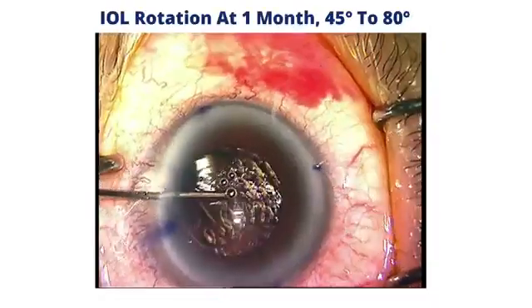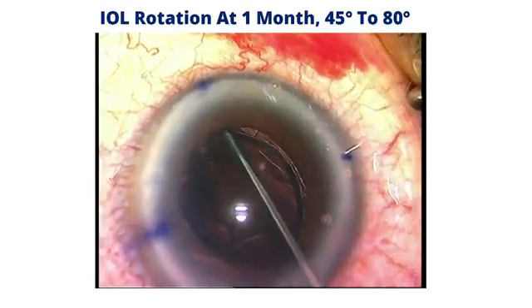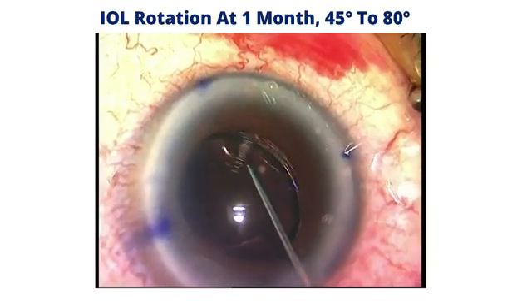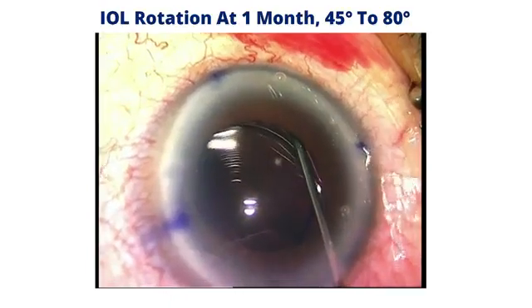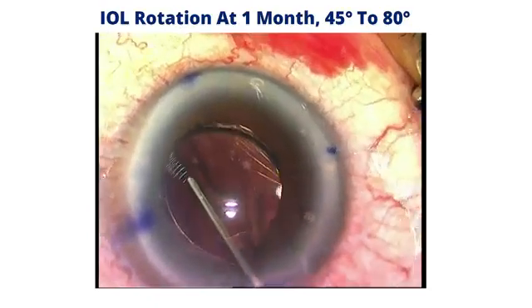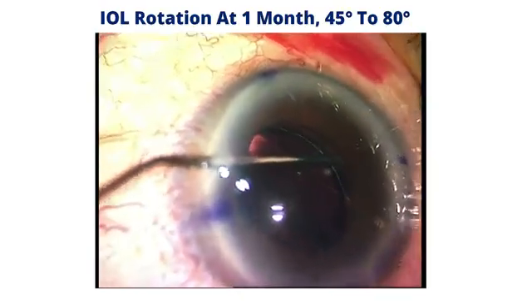Now this patient that you see next has a multifocal toric lens, and you can see, in addition to the fact that this is off the axis I intended, the lens is not centered. Of course, with the multifocal lens decentered, we know that it can cause aberrations that induce further astigmatism and a blurring of vision. So I'm going to explore this case, and just to point out already, you can see some striae here on the posterior capsule.